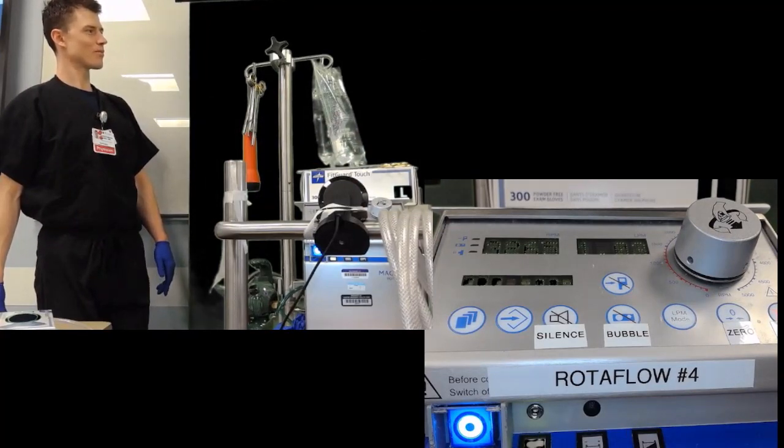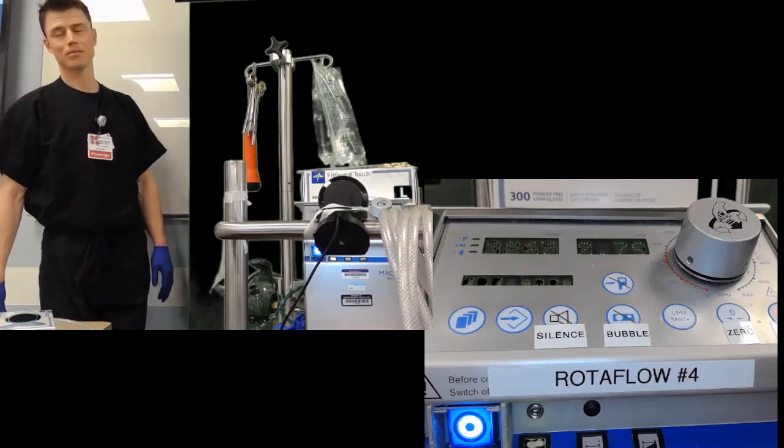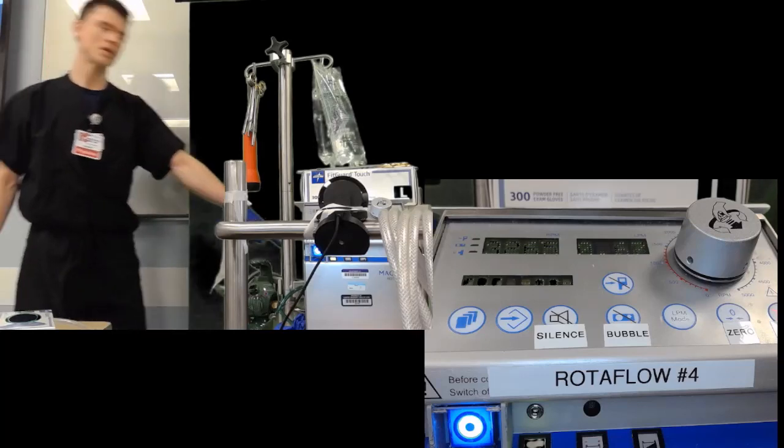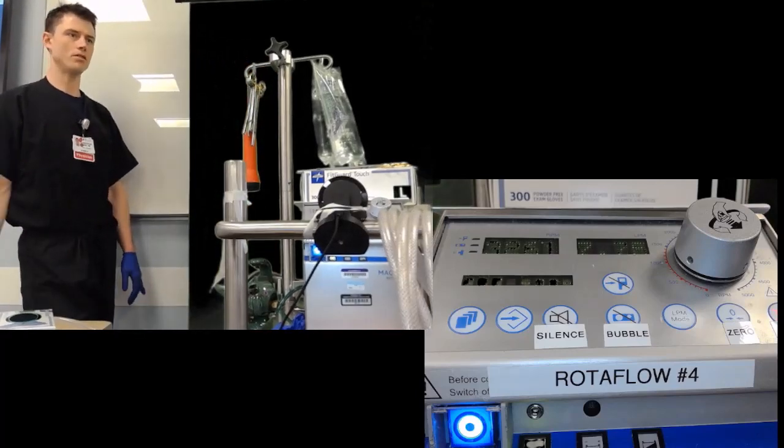We couldn't figure it out until we took the tubing and the bed sheet, and the tubing was partially clamped by the bed sheet. So when I laid him flat, it completely occluded everything. But yeah, that was fun. You guys can see there's a big kink here. That's why we weren't getting flows. So it's always important to run our circuit.